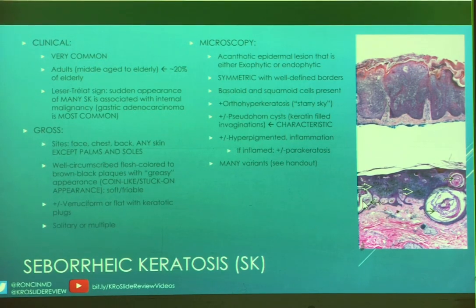So in the bottom picture, you can see that we have a lot of examples of these pseudohorn cysts, okay? They may or may not be hyperpigmented, they may or may not have inflammation, and if they're inflamed, you may or may not see parakeratosis. So there's a lot of what ifs with these lesions. And there are many, many variants, which are all in your handout, because we are not even going to attempt to go over them all.